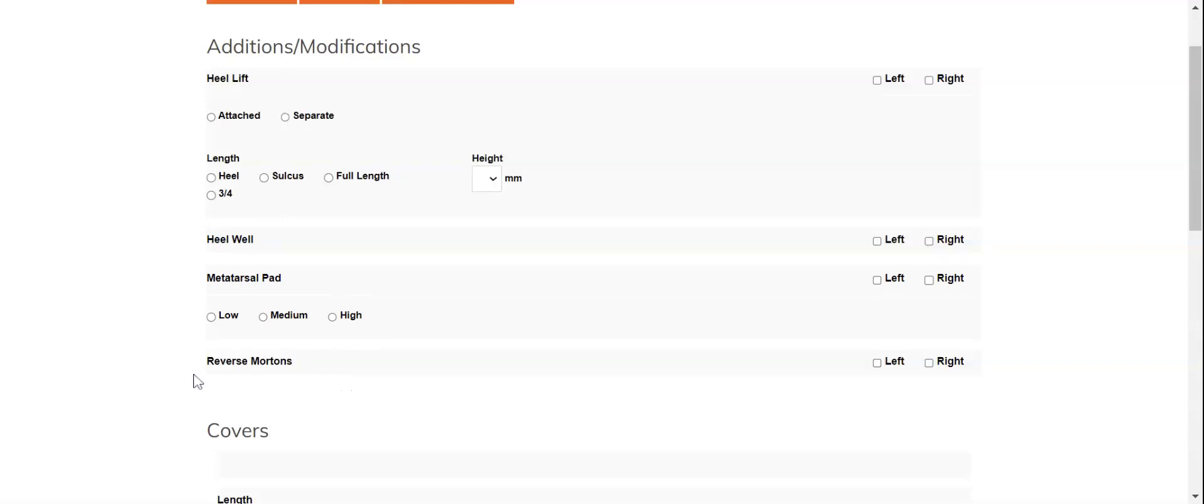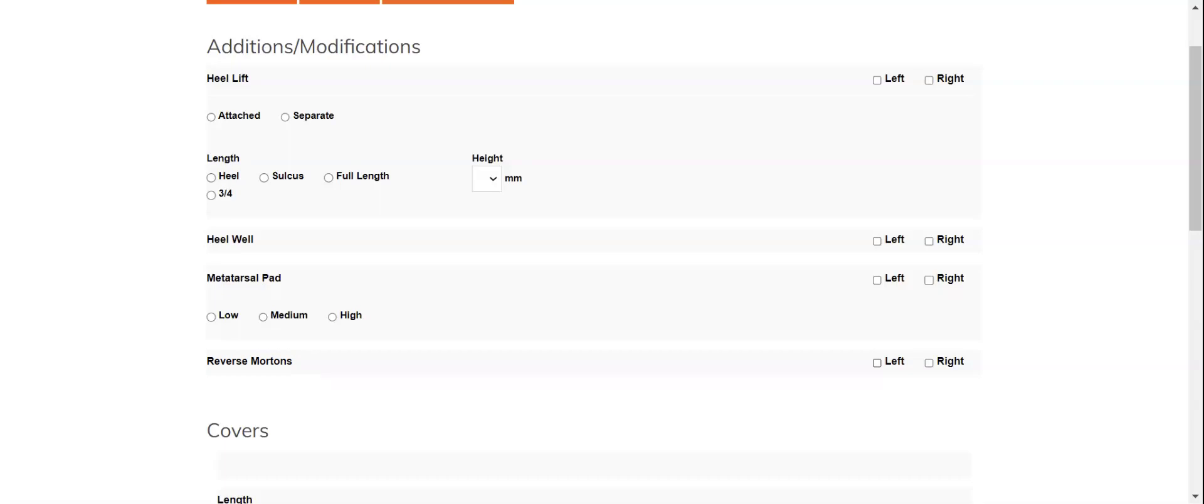Please note that reverse mortens, if you're familiar with what this is on our order form, will be going through some changes for clarity in the upcoming months, so it may look a little different by the time you look at this.